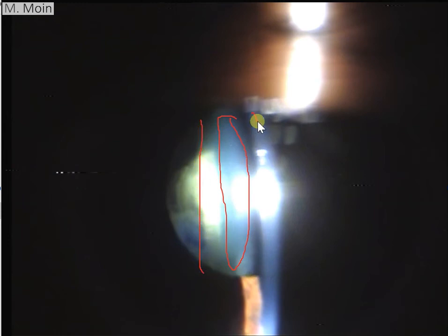And this is what you're seeing, this is the posterior part of the slit beam, this is the anterior part of the slit beam falling on the cornea and this is the posterior part which is falling on the posterior capsule and this is also highlighting that area of posterior polar cataract.